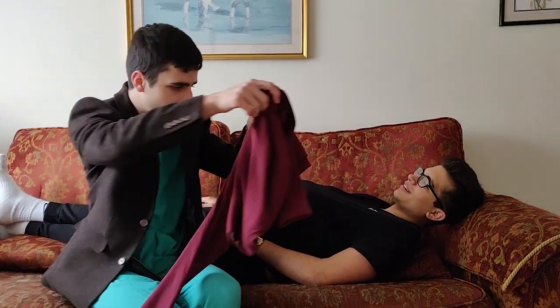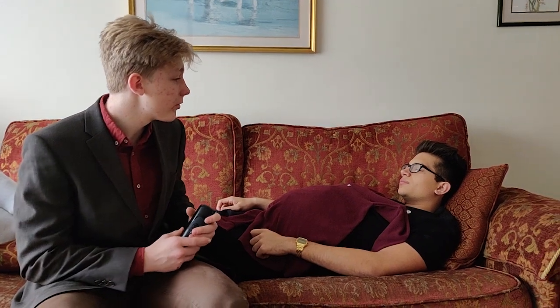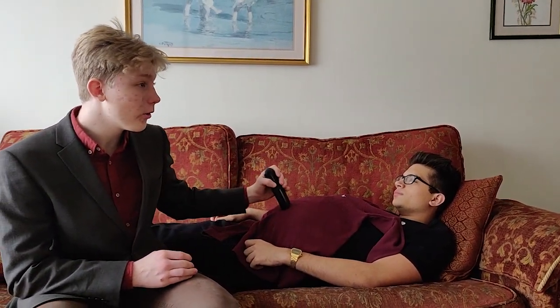What's that? I'm glad you asked. We need to use a contact gel because of a property of materials called impedance. Air and skin have very different impedances, which means if we send the sound waves through air, then nearly all of the sound waves are going to be reflected off his skin. But if we use a contact gel, which has an impedance very similar to skin, it means that very few of the sound waves are going to be reflected off the skin. In order to properly understand impedance, we need to talk to a mathematician.